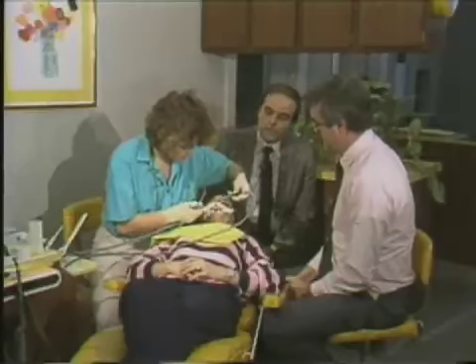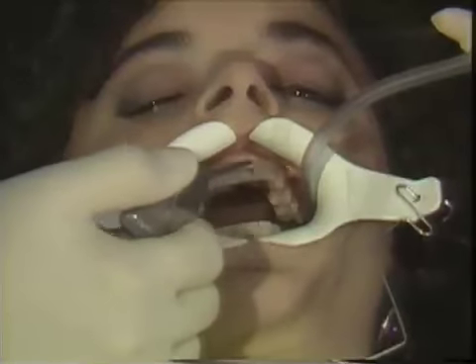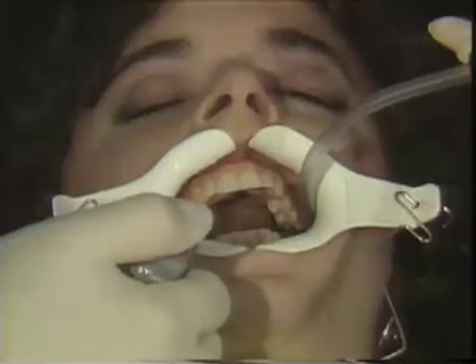At this point in time, the acid must be rinsed thoroughly, and you'll notice Liz is squirting all the teeth quickly with a stream of water, combination water and air spray. This stops the etching process.